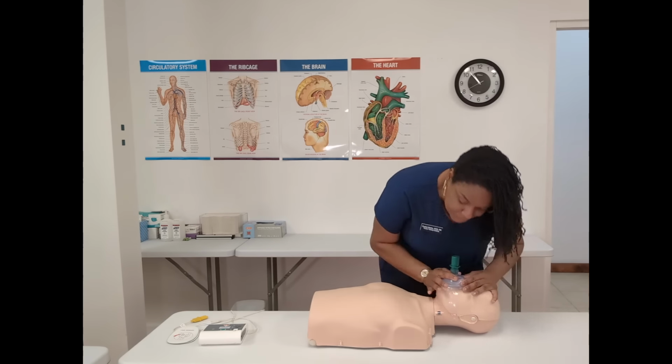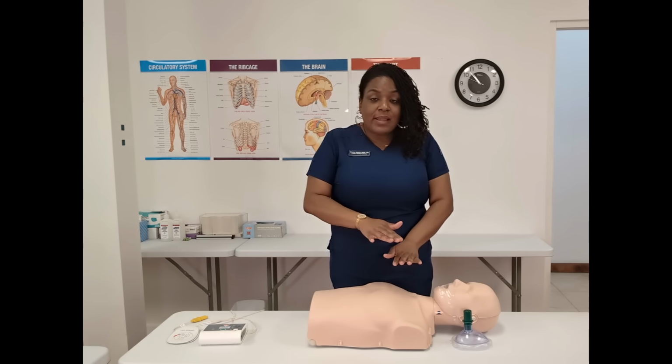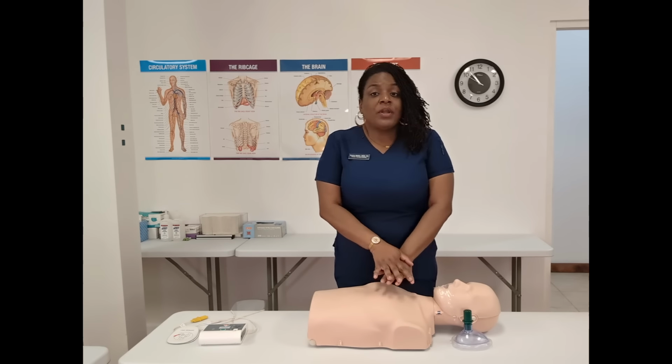Whenever you're compressing, it's really important that you allow for chest recoil. What chest recoil does is, whenever you compress down, you circulate blood. When you allow the chest to rise to its normal position, you allow the heart time to fill back up with blood. So if you're pressing really fast, you're not allowing full chest expansion. So press down, let it rise, and you're going to continue doing this until the scene becomes unsafe, or until the victim has signs of life.